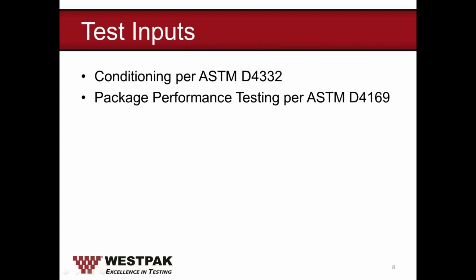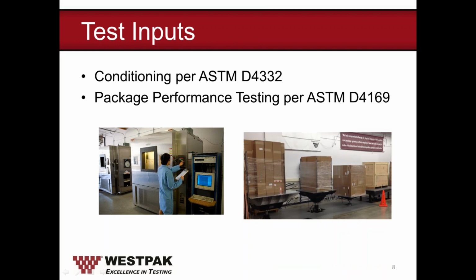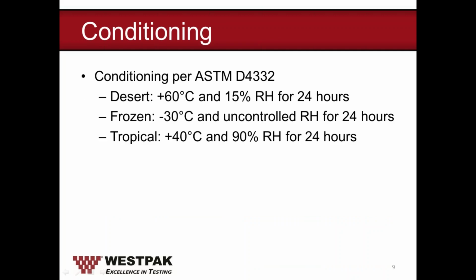The test inputs. This particular client did conditioning per ASTM D4332, followed by package performance testing per ASTM D4169. Let's get into more details of the conditioning.